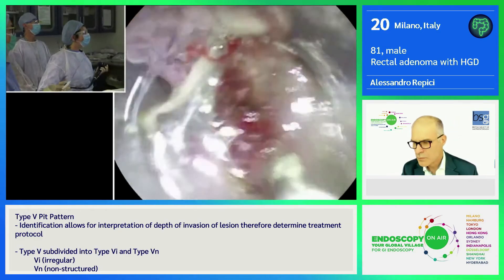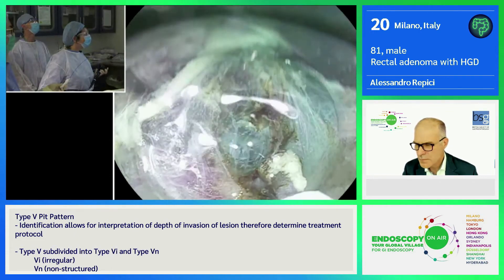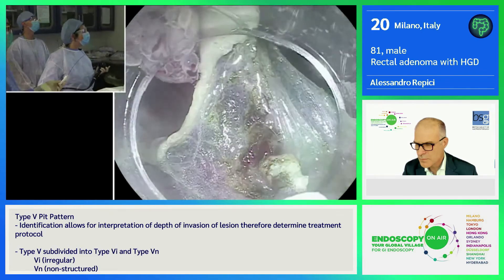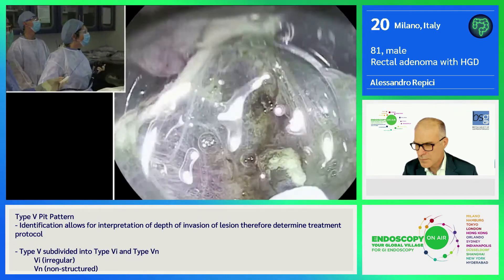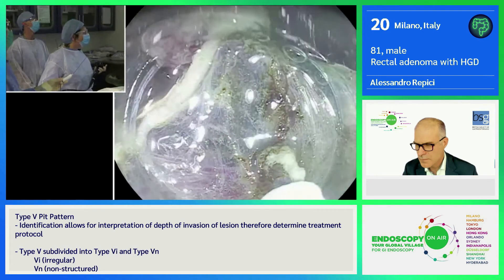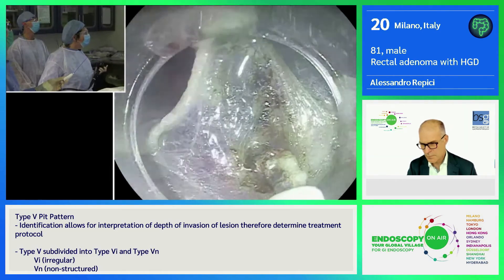Do you think that just injecting with the hybrid knife can provide an additional hemostatic effect? I use it like this, yeah. And then I stay there and precisely... Very beautiful demonstration of all spaces. Sometimes it works; sometimes when the vessel is too big, it doesn't. I already used and opened the bipolar forceps for this lesion because I encountered very big vessels. But let me see if this one is working. It is. Good.